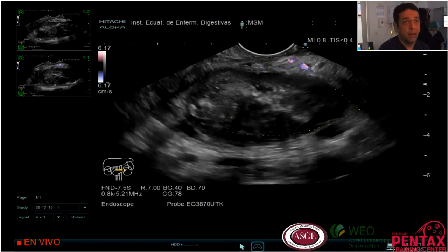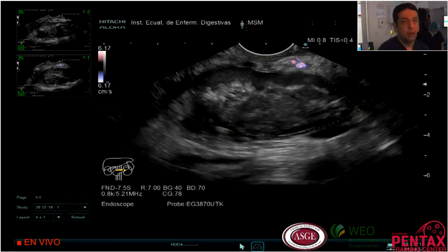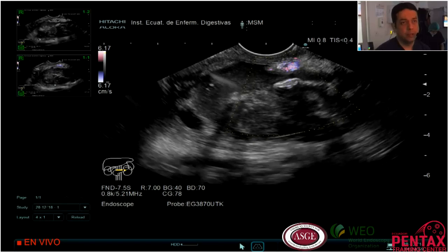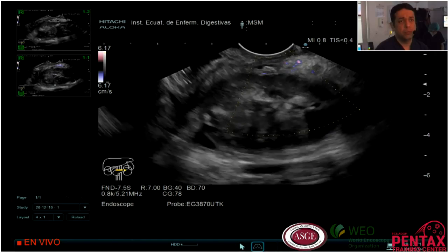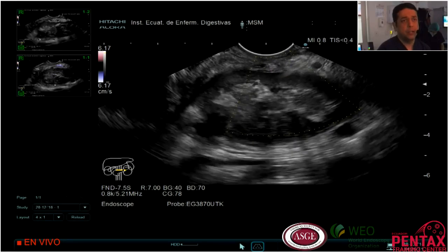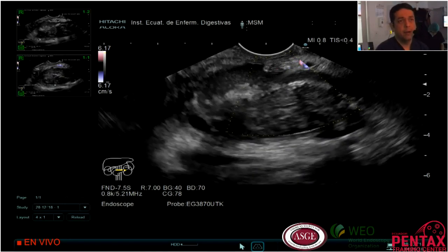I already had some adverse events when we perform a drainage. Overall, if we use electrocautery, which we will use in this case, we need to avoid these vessels. So just to have a little bit more security, when I see these kinds of vessels, I try to pass my needle first and then pass a guide wire.